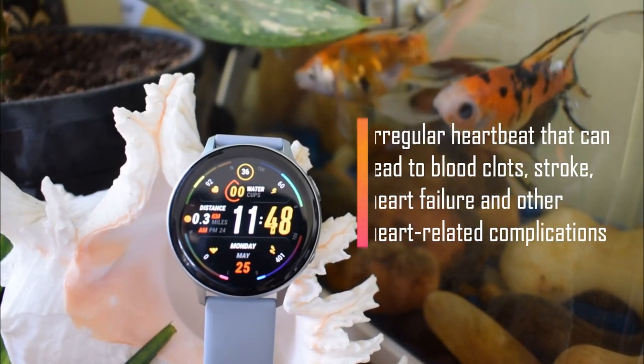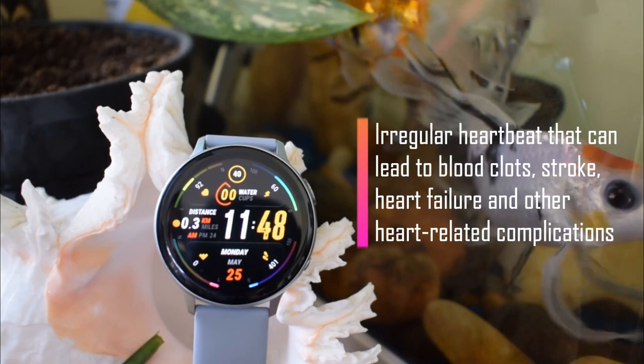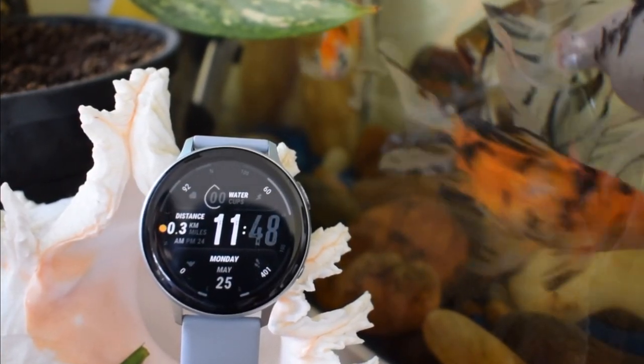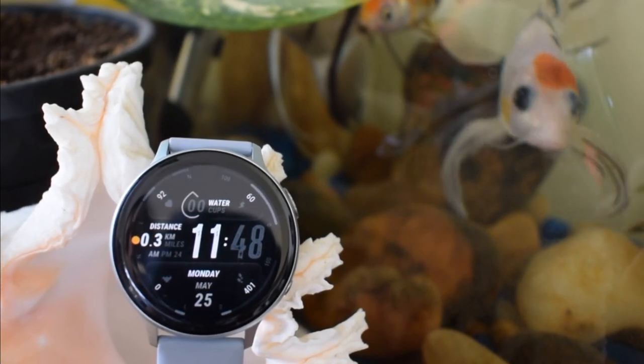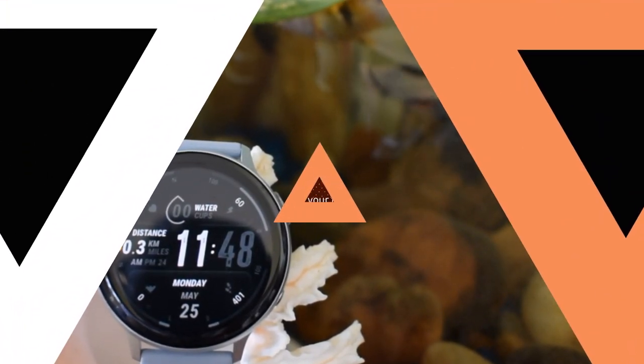that can lead to blood clots, stroke, heart failure, and other heart-related complications. This feature on the watch is going to help us detect irregularities in the heartbeats, and the results can be shared with the doctor to make more informed decisions. So how does this work on the watch?